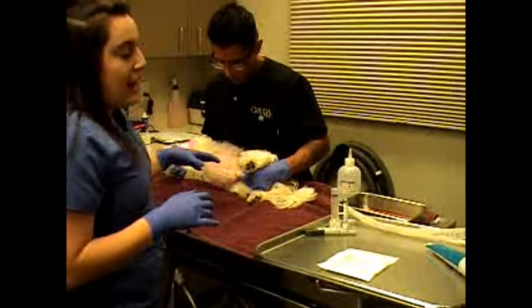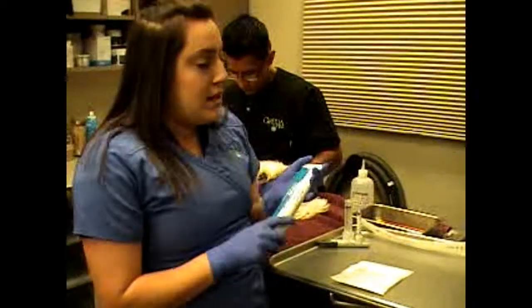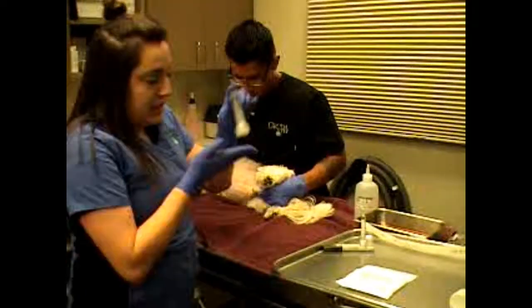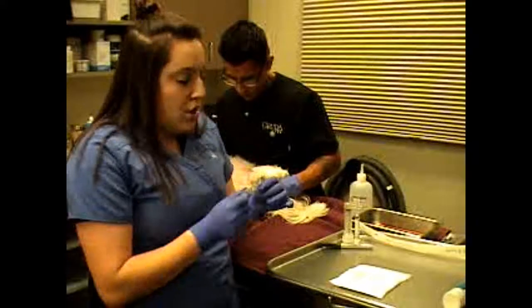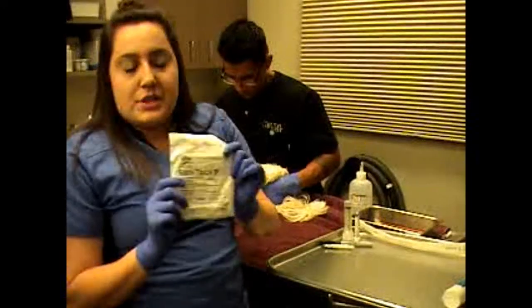We could always use a polypropylene rigid catheter as well, but these ones are a little bit easier to feed in these smaller guys. We've got a brand new tube of sterile lubricant, which Rachel will open for us when we need it. We've got a 12 cc syringe, our little vacutainer for our urine sample, a Sharpie to mark our container, a new 22 gauge needle, and then we've got a pack of sterile gloves.